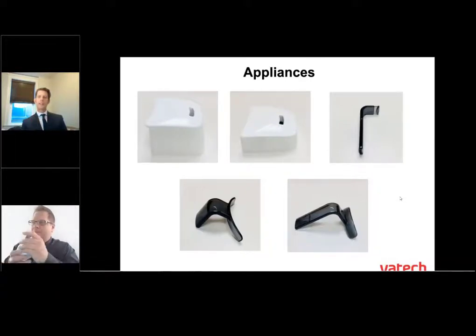So let's go through with the bite stick, just like we did before. Paul, have the patient bite on the bite stick, and gently push on the chin or the bite stick to make sure the chin is flat on the chin rest. That's going to give us our maximum height. If his chin is off the chin rest, we're going to get some patient movement, and we're also going to be losing part of our superior border there. If the patient does need to be in a centric or natural occlusion, we're going to take the bite stick out. We're going to use our edentulous chin cup.